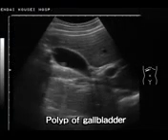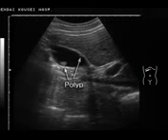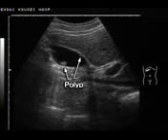This is a polyp in the gallbladder. On the wall of the gallbladder, a 3 by 5 millimeter polyp is seen. On the gallbladder bottom, you can see several polyps of 1 to 2 millimeters inside.